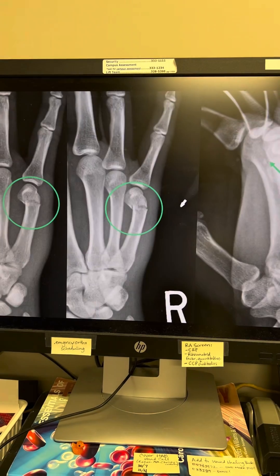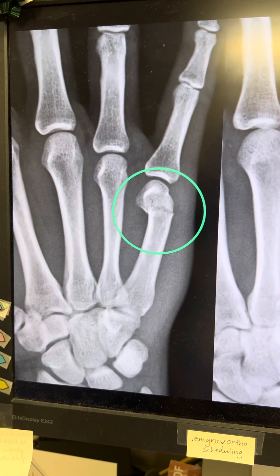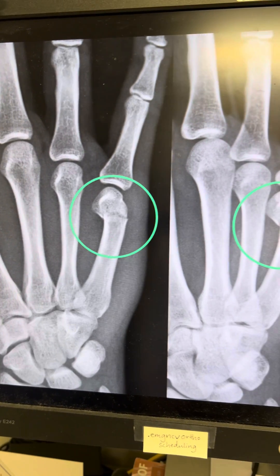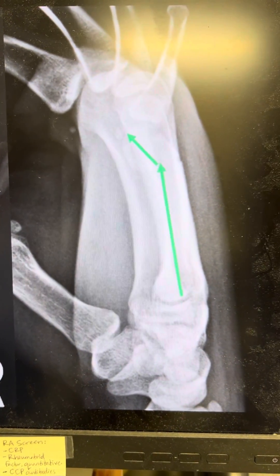This case reviews a fifth metacarpal fracture. On the PA view we can see a fifth metacarpal neck fracture. There is slight shortening compared to the third and fourth metacarpals, but we can only measure angulation on a true lateral.